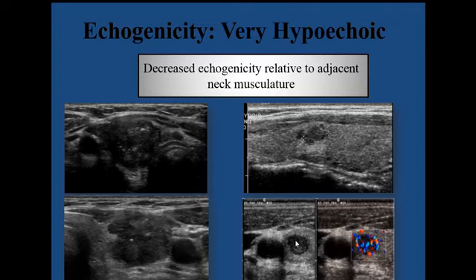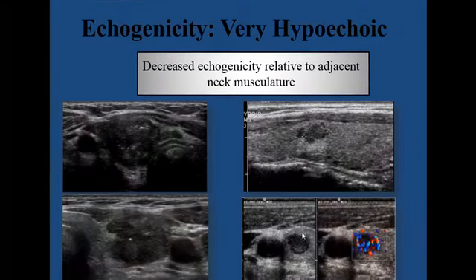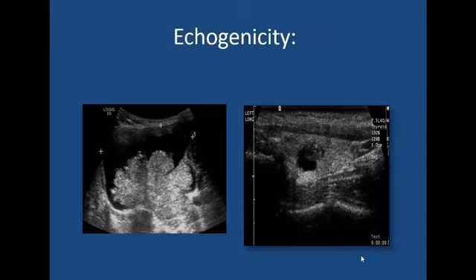And actually sometimes the hypoechoic nodule has acoustic enhancement. And in order to make sure that you are not dealing with a cyst, if you put your color box, you will see the vascularity.